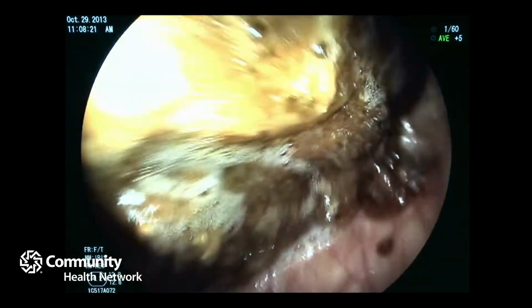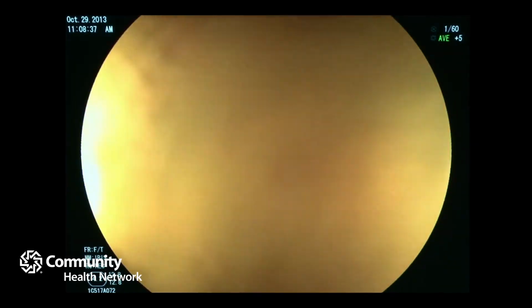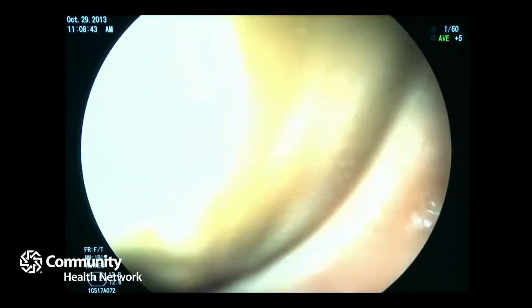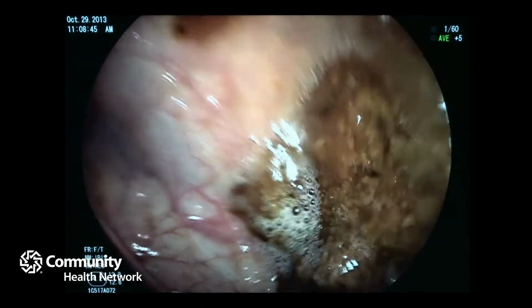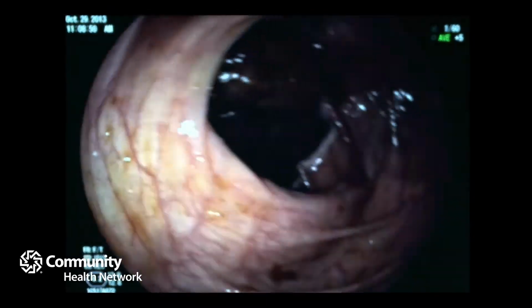So going back to your question, yes, if you have Crohn's or colitis, you are at absolutely increased risk of developing colon cancer. That's why it's important that you get your colon checked. I need some flush. As you see here, I've got a little bit of stool stuck that I can't get off. She's just going to flush it away. Thank you. And most of the time, for those Crohn's and colitis patients, your gastroenterologist, whoever's managing that, will be absolutely on top of that.